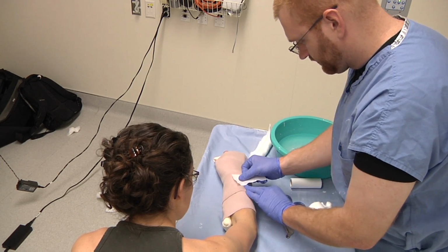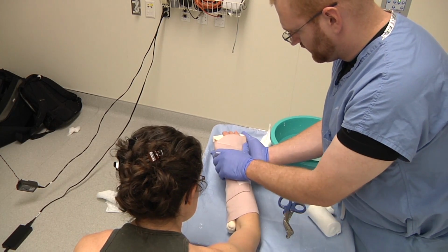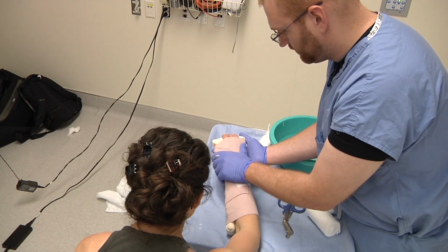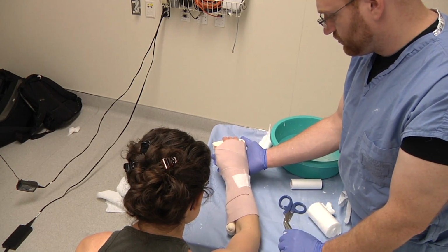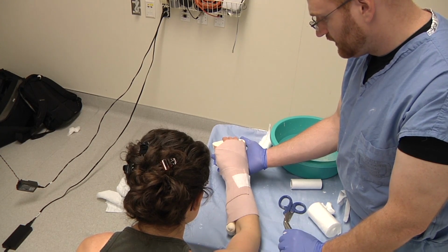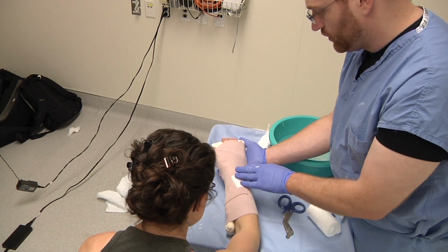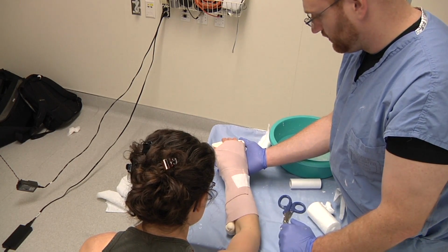Can be taped, and make sure that they're in a position of comfort. There's nothing sharp or pokey, and allow that to dry. This can later then be easily removed for evaluation of any wounds and reapplied as long as it remains unsoiled.